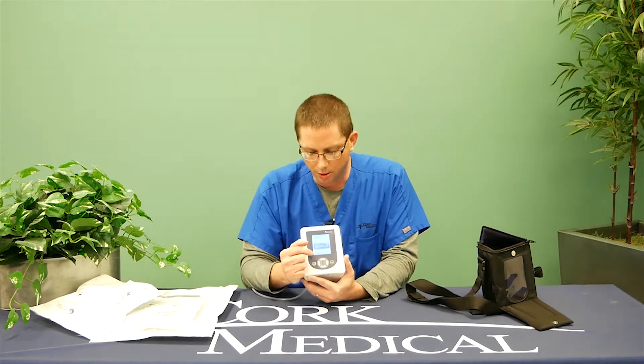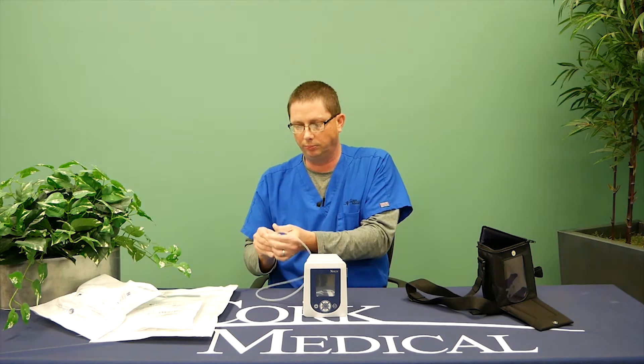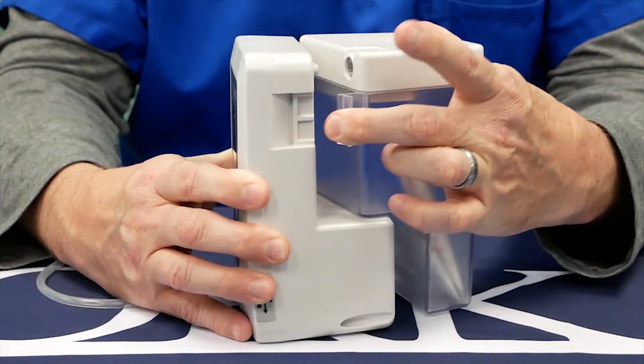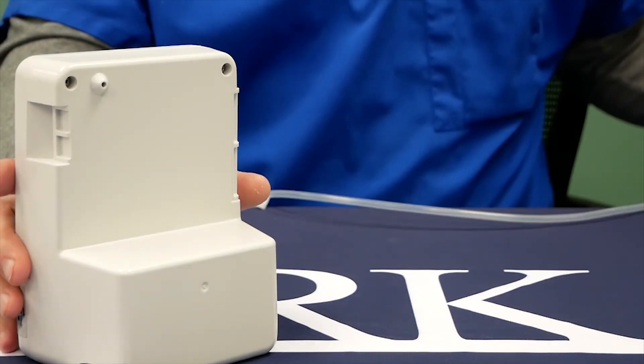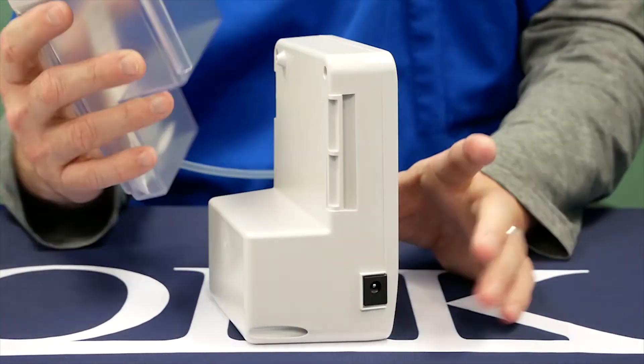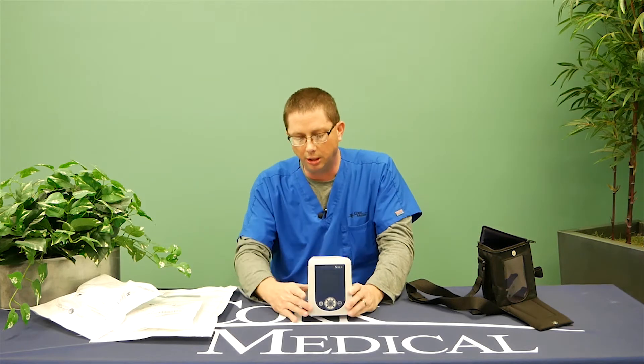One of your responsibilities as a patient is that you will have to change the canister if you receive a canister full alarm, meaning the canister is filled with drainage. On the screen, instructions will pop up. The first thing it says is to power off your pump. Next, you'll have a clamp on the canister — you clamp that, then remove your canister and dispose of it in a trash bin. From there, take your new canister out of the packaging, place it on your pump, lock it in place, unclamp your tubing, and power on your pump, and your therapy will resume as previous.